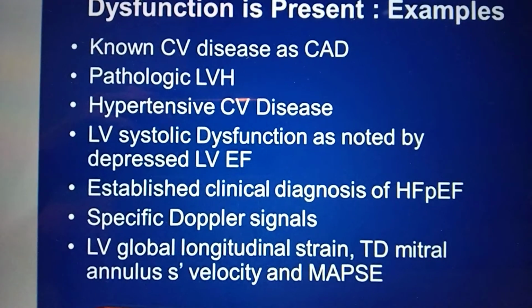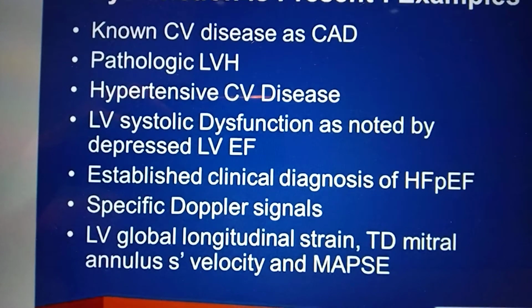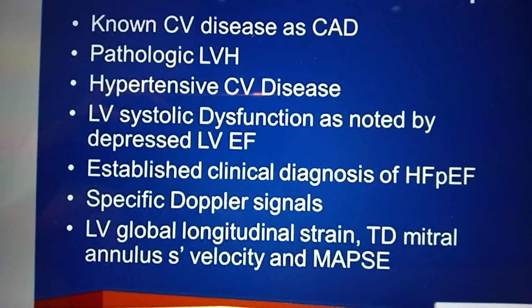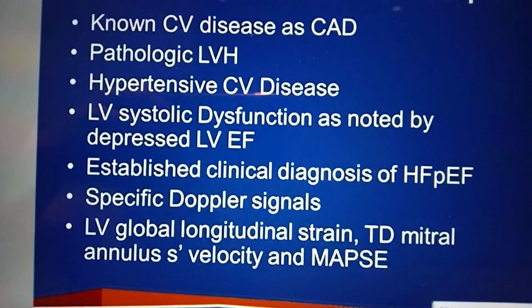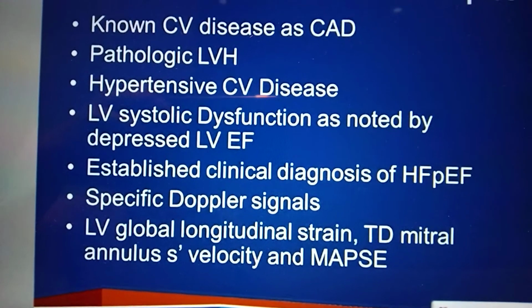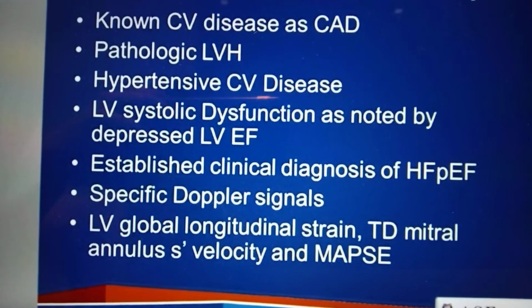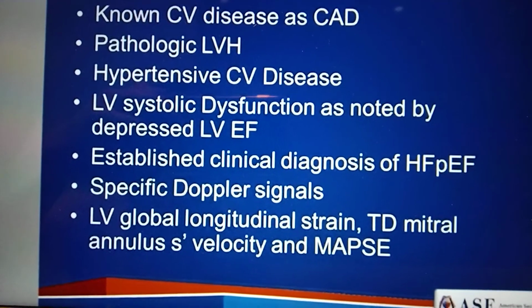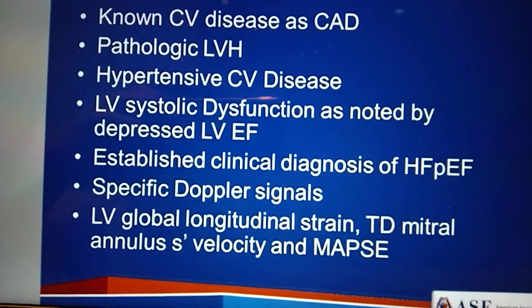A lot of it will come from clinical and 2D data and not just Doppler findings. So I want to emphasize the importance of trying to gather this data. For sonographers, you can go to the patient's charts as well as asking patients. And for physicians, sometimes we have direct access to the patient records, depending on the electronic health record in a particular place where you work, and that data should be sought and looked after if not provided by the sonographer.